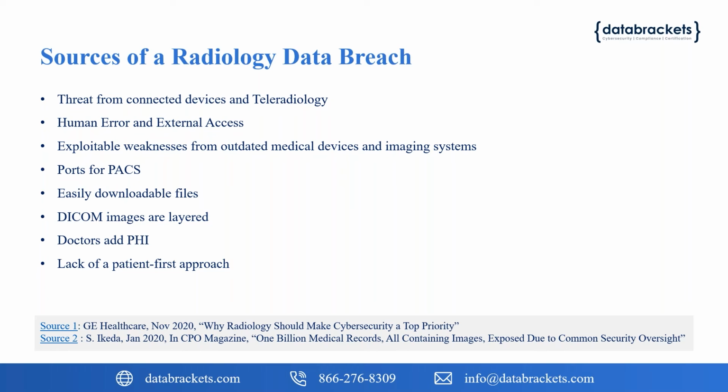And the next one is easily downloadable files. As we saw in the earlier slide, most of these images are created with a .dcm extension, and whether you use your browser to view them, or a plug-in, or any kind of specialized software, these files are easily downloadable. What it means is anybody could read that file if they have a simple viewer for the DCM image. Those are not encrypted most of the time. So that is another issue with the sources of the data breach.